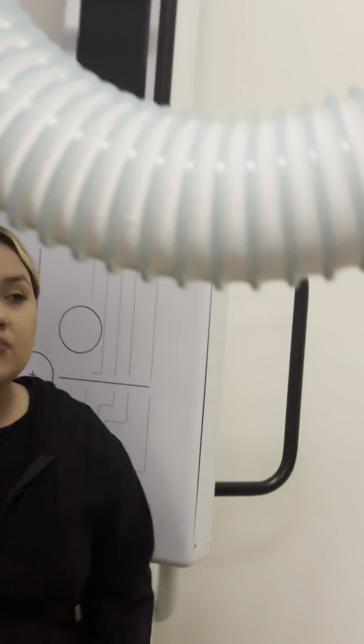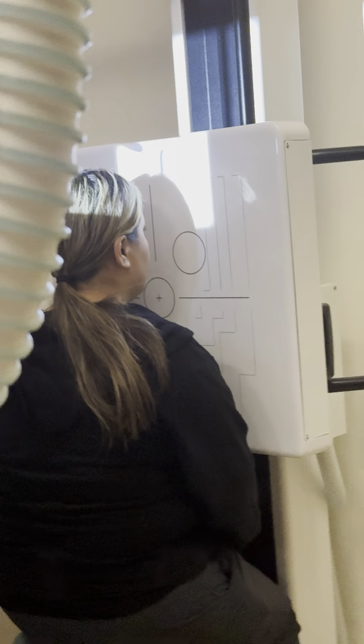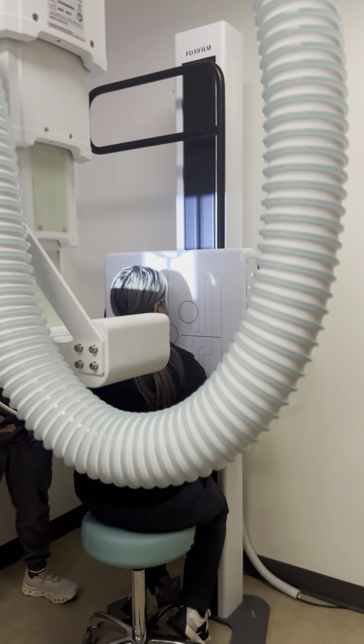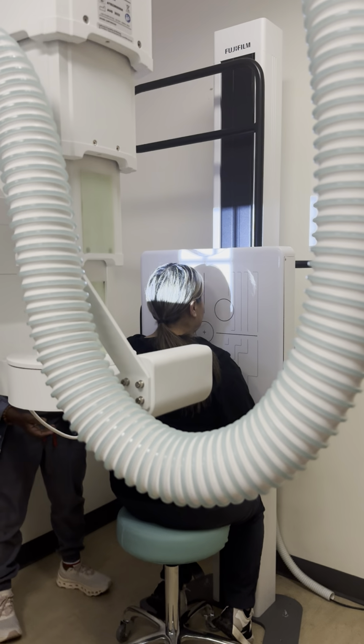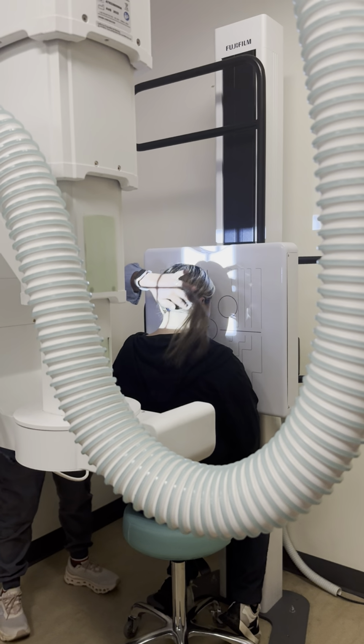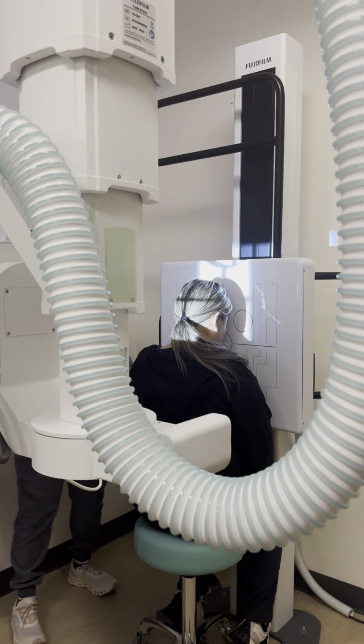A PA would just be the reverse of it. So on the practical, is it going to say whether you want a PA or AP? No, I'm going to fool you. Why wouldn't I tell you which way you're going to do it? Go ahead and tuck your chin down so that she uses the orbitomeatal line.